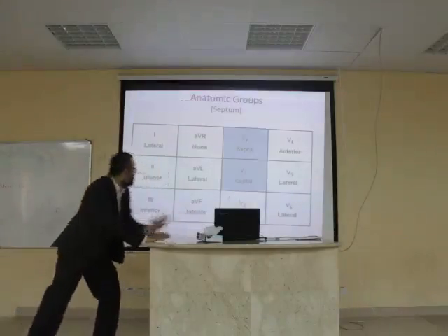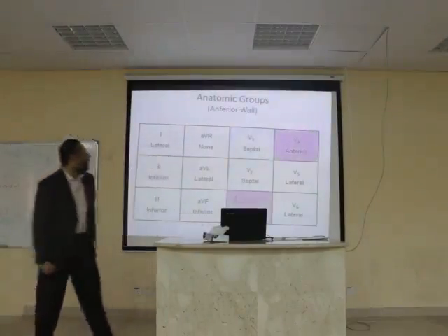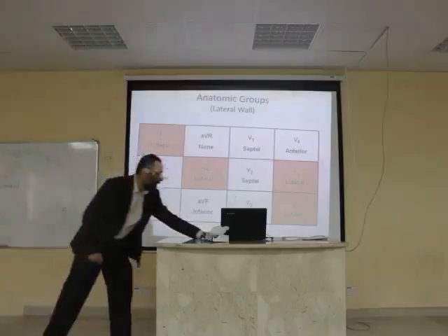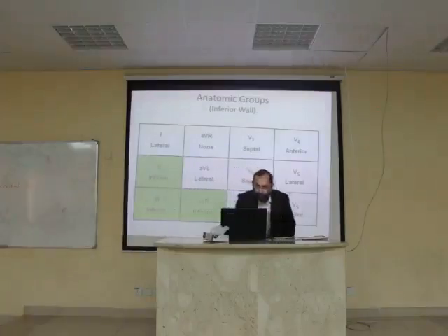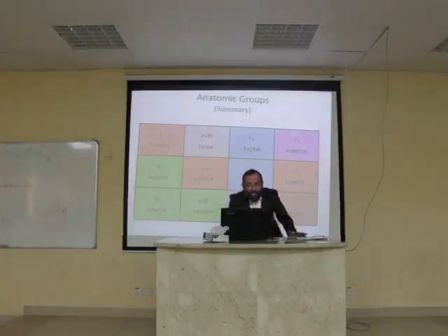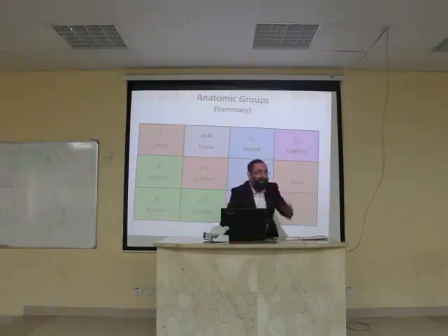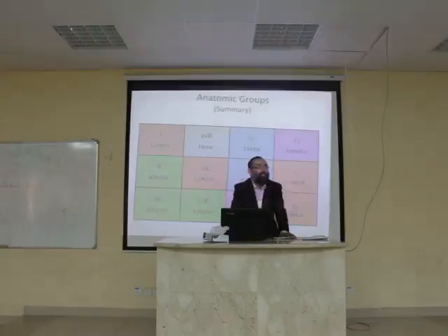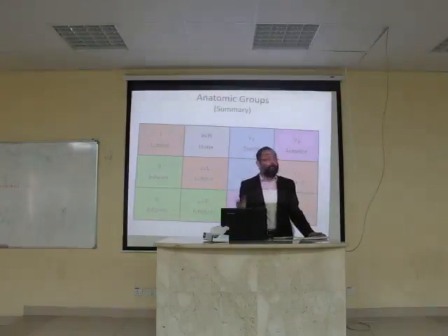Now, quickly see. What is it showing? V1, V2, septal, okay? What is it showing? Left side. Great. What is it showing? Done, okay? Got the point. This is the complete system, okay? And what is written in the slot of the AVR? None. It is not none actually, okay? It does signify. Now we are approaching, but usually in the ECG, because right atrial infarctions are least likely and fewer changes are seen, we have not considered it very much. But even this AVR gives you changes.